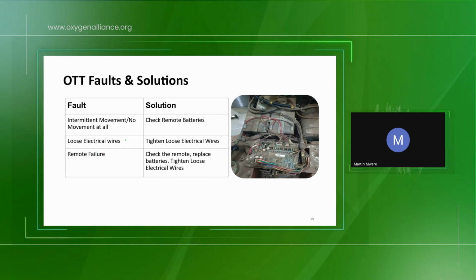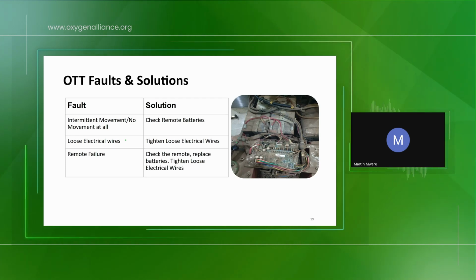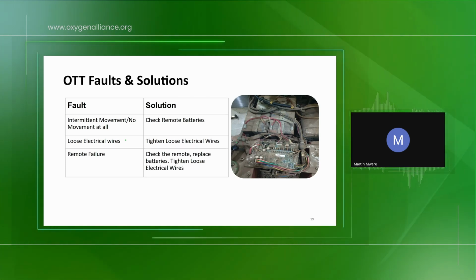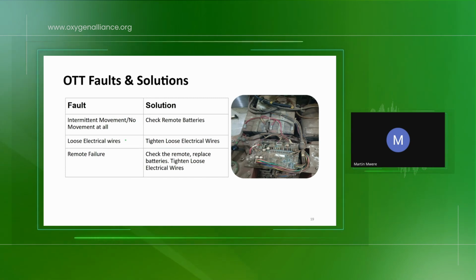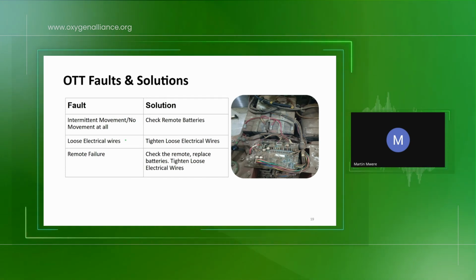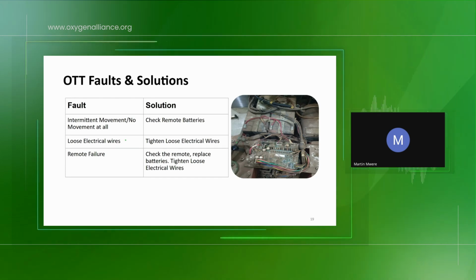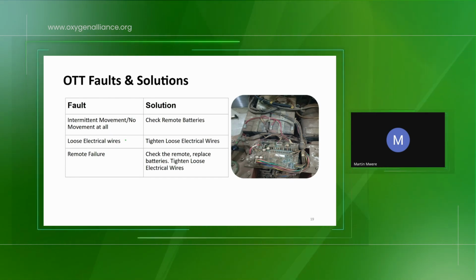Once it produces those sparks, the electronic components will short. That short circuit will burn this PCB board, or there will be no production of the required voltages. So every 4 months or after every 6 months, the operating theater table must be serviced.